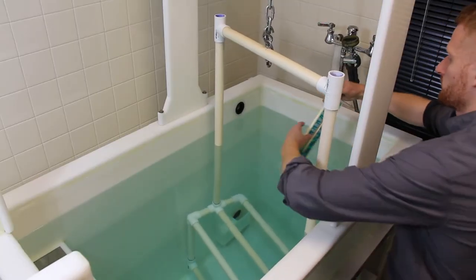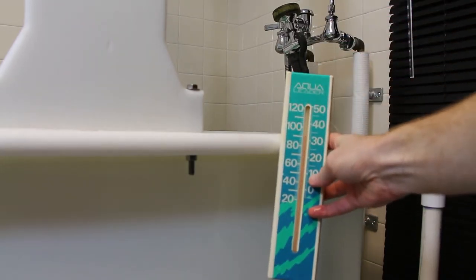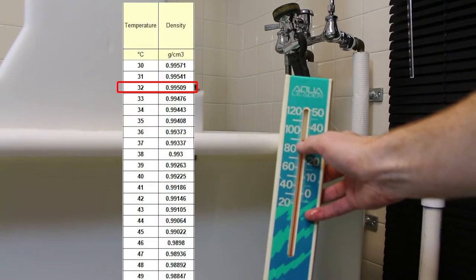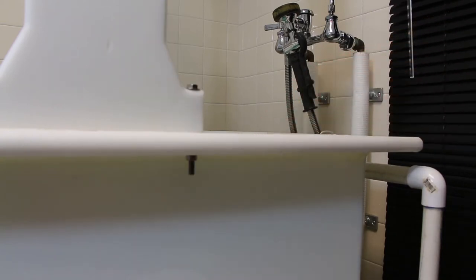You're also going to measure the temperature of the water. This entire test relies on the fact that water has a certain density, and the human body has densities that vary within it. Fat tissues are less dense than water, where lean tissues are more dense than water. We have to know how dense the water is in order for all this to be calculated appropriately, and water changes its density depending on temperature. You measure the temperature in degrees Celsius and then look up in a table what the specific gravity — that is, how dense the water is — and that goes into our equations.